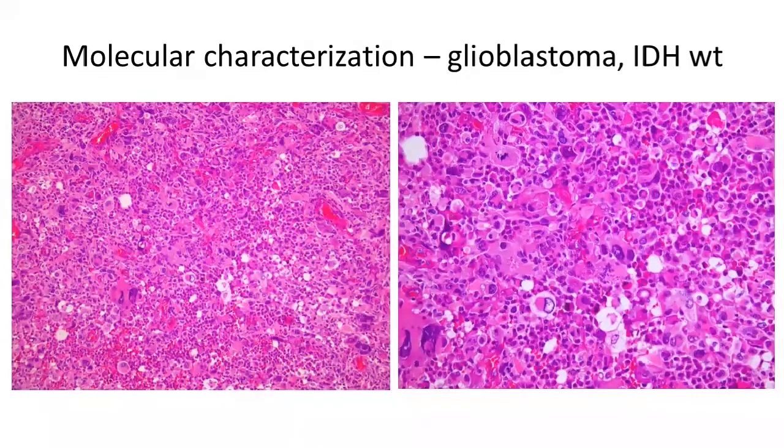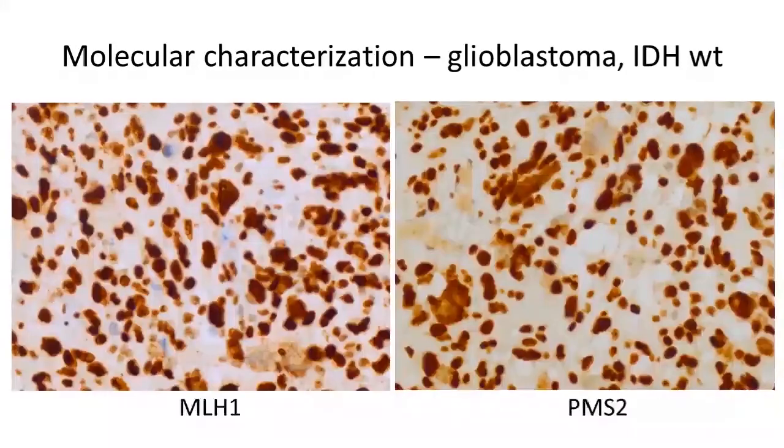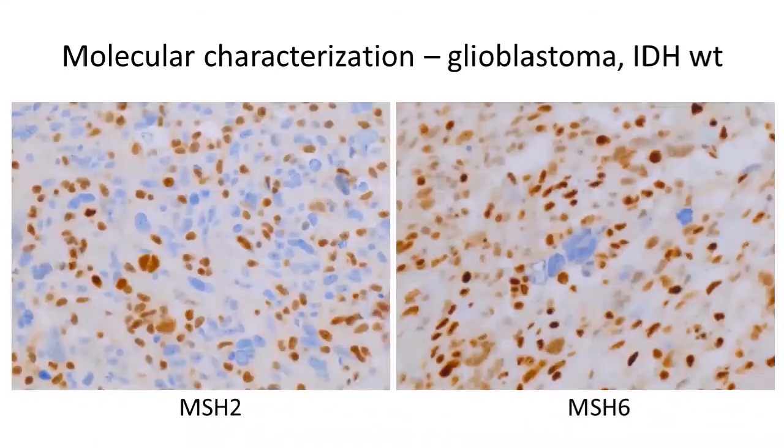And it is known that these tumors with a hypermutated genome sometimes have MMR, also mismatch repair deficiency, and might benefit from microsatellite stability analysis because they do not respond to certain types of treatment which need proficient MMR tumors to actually be effective.